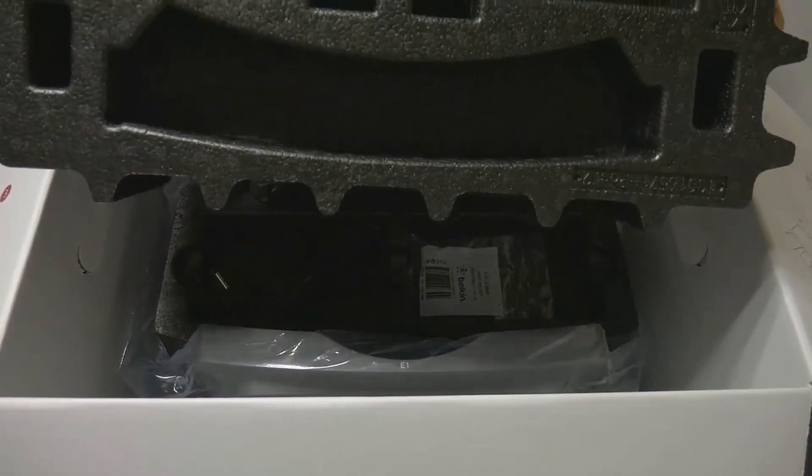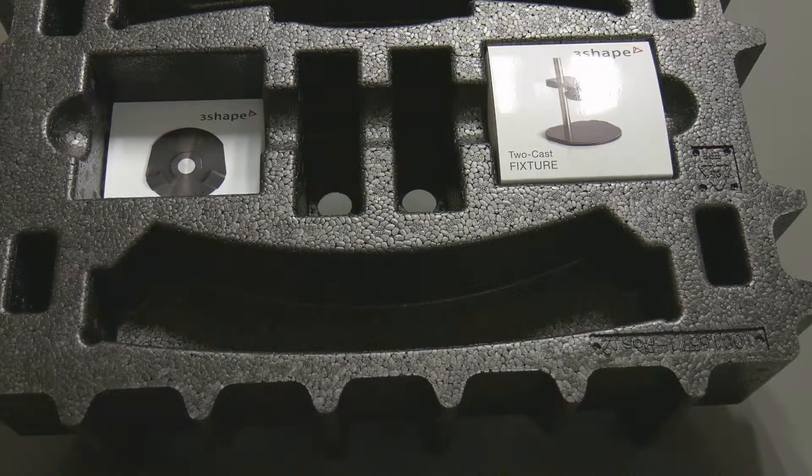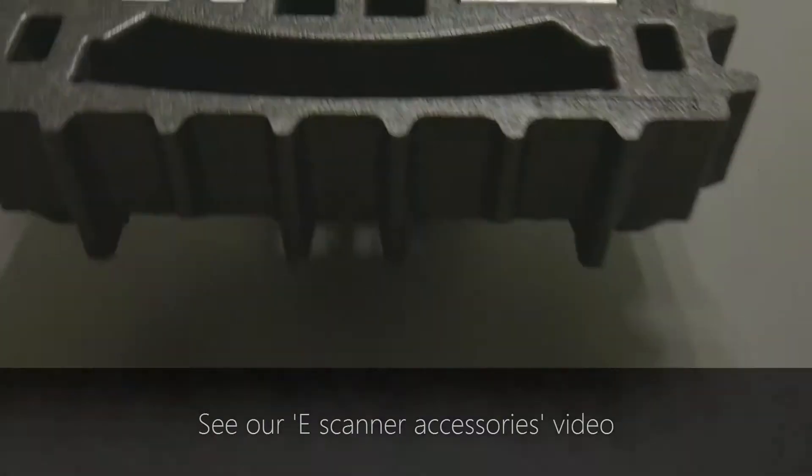Carefully take every insert out and place it safely on a level surface. The uppermost insert contains room for accessory boxes added if the client ordered them together with the scanner. Please see the e-scanner accessories video for details.